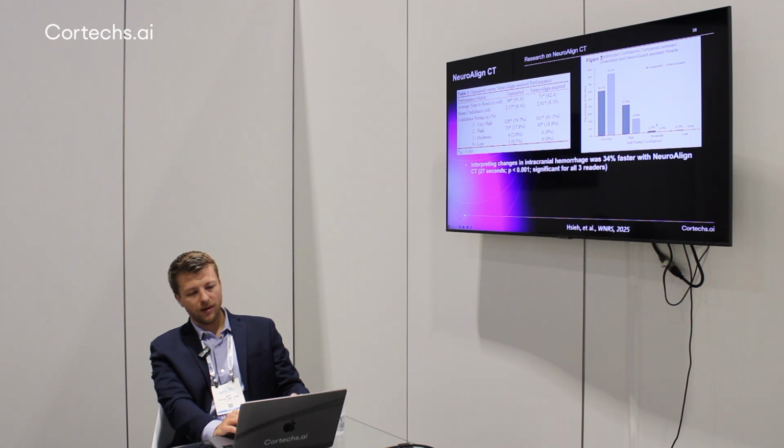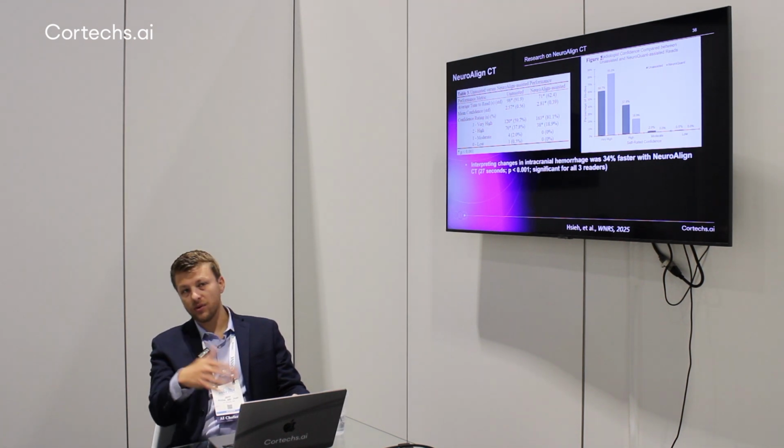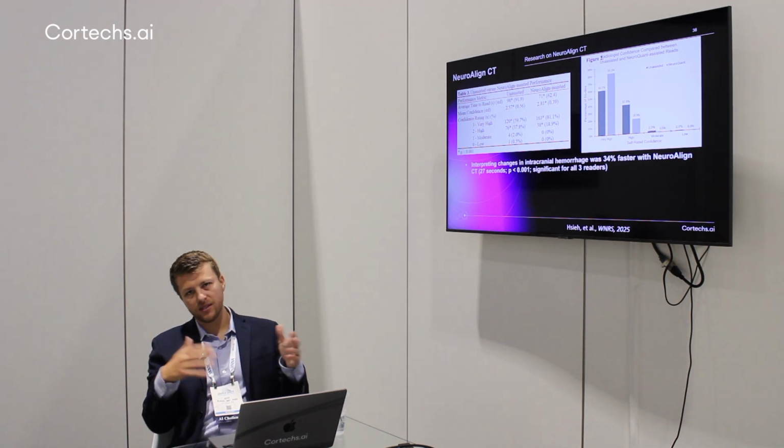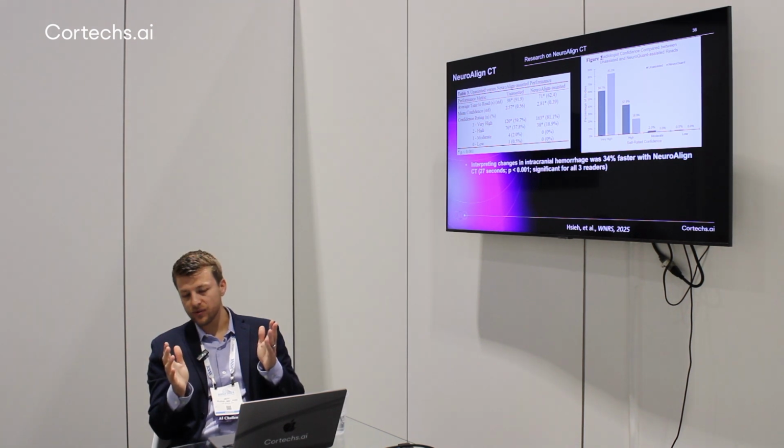So here is one of the reader studies I was mentioning that we presented at WNRS and is being written up. What we did is we took about 200 cases of intracranial hemorrhage with follow-up. We had 3 different readers look at time 1 and time 2 and come up with an assessment of whether the intracranial hemorrhage increased, decreased, or was unchanged. We went to the radiology reports and tried to find the ground truth, and if there were inconsistencies, we had to adjudicate what was truly the ground truth.